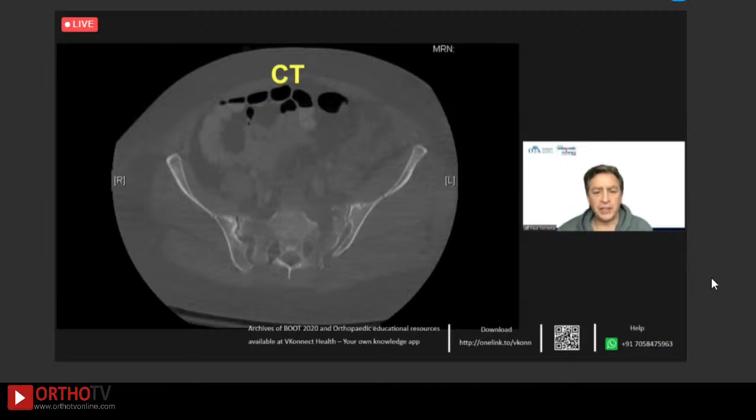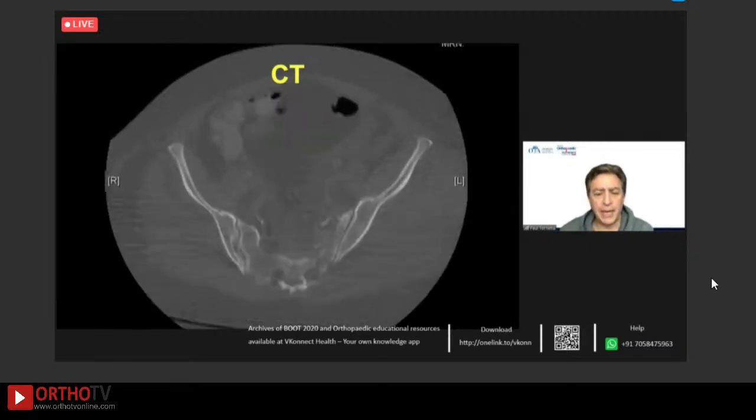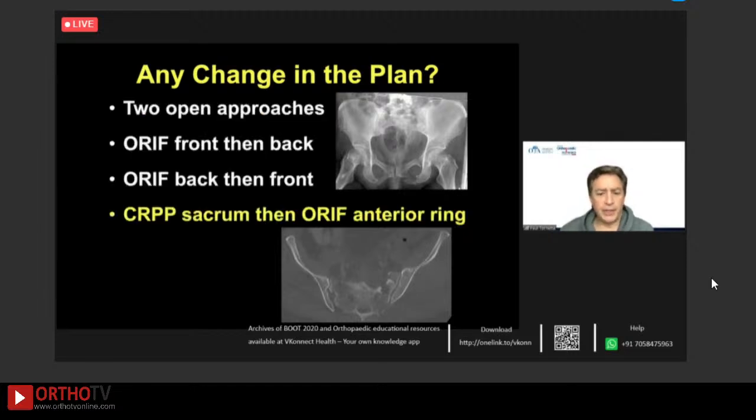This is just the CT sort of showing, you know, nothing surprising, I think, for anybody. Unilateral injury in the back and bilateral injury in the front. To me, that CT didn't tell me anything I didn't already know. So again, we go to these options.